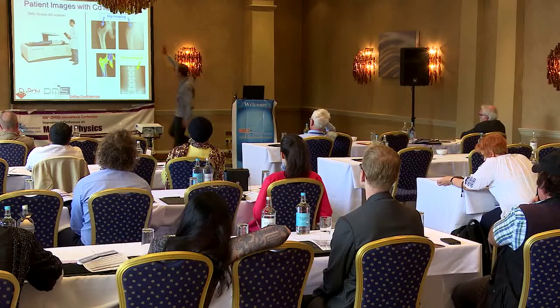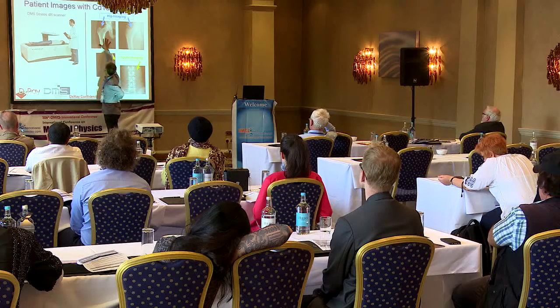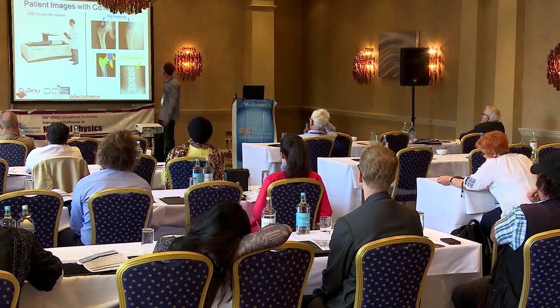This is what the fully integrated image looks like with a conventional integrating detector. This is what the image looks like with the photon counting detector, where we can identify non-bone and subtract it from the material. Also, the high resolution of the detector lets us do cortical bone imaging in the spine.